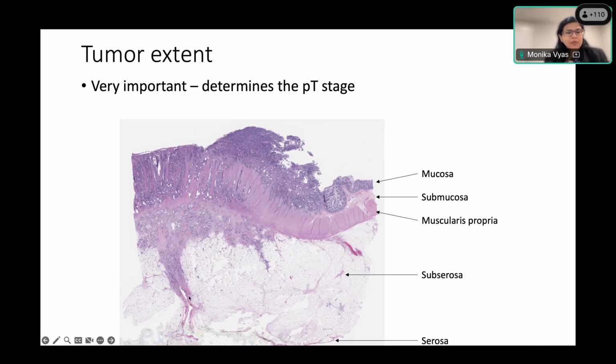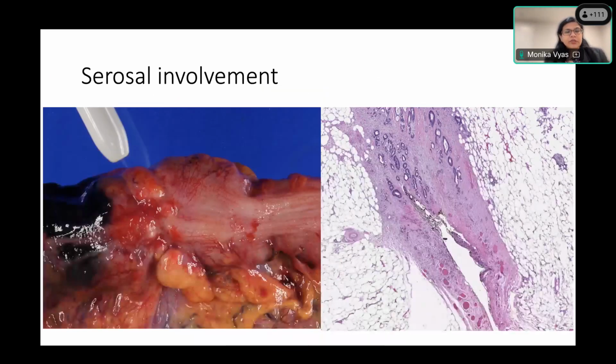And it's very important to pay attention to these small crevices that you see in the serosa, because that is most commonly the T stage discrepancy that we encounter, because people are not paying attention to these little divots in the serosa where it dives down. So even if the tumor is involving the serosa in this deep part, you will call it a serosal involvement and pT4 stage. So here's an example.